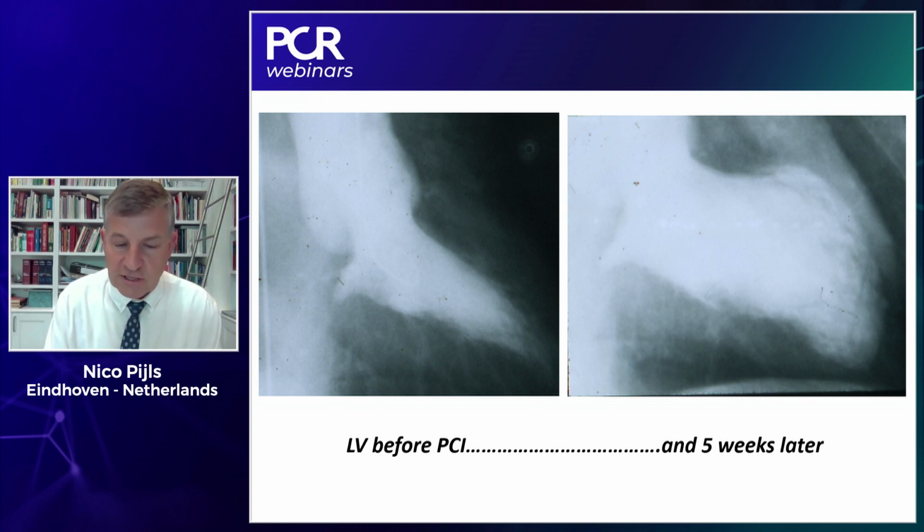On the left hand, you see the left ventricle of this patient before the procedure, and on the right hand, a few weeks later, after the procedure. 1 year later, this patient died from untreatable heart failure.